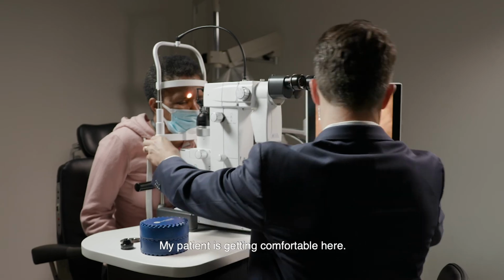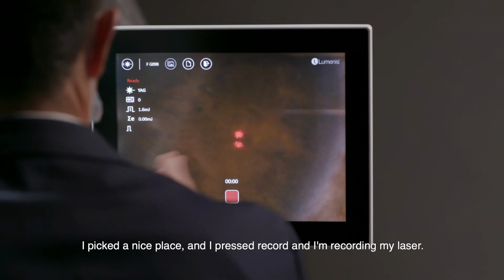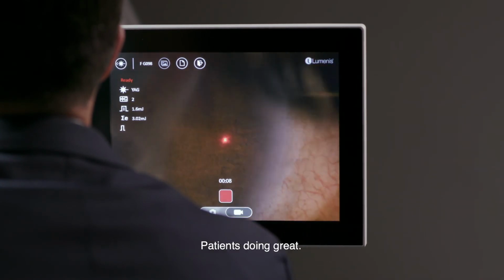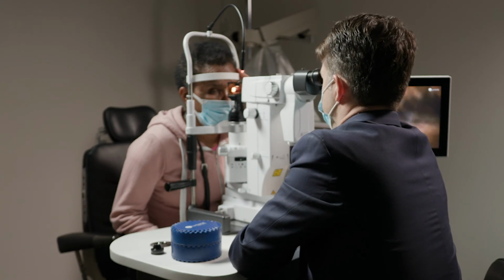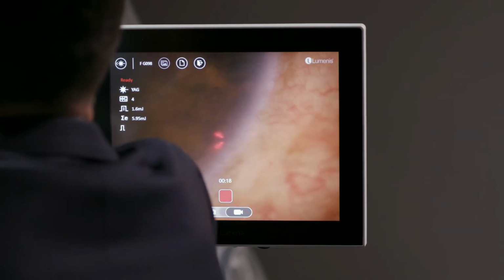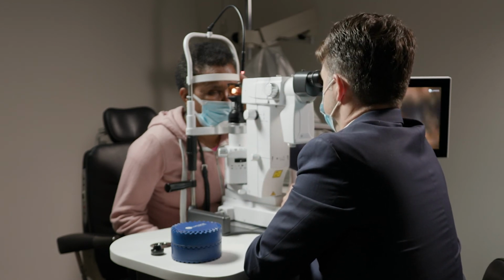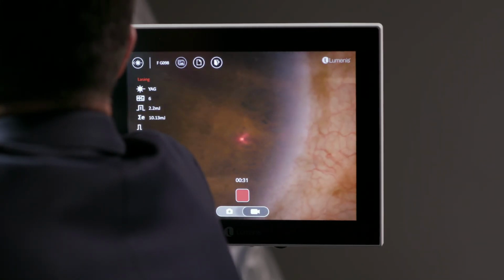Okay, my patient's getting comfortable here. So I've picked a nice place, and I've pressed record, and I'm recording my laser here. Patient's doing great. Okay, come forward. Here we are.